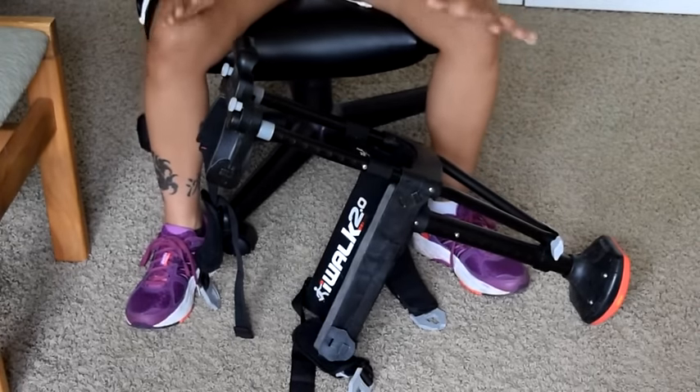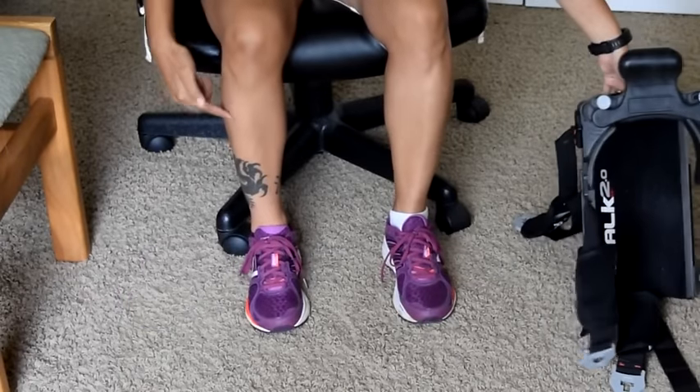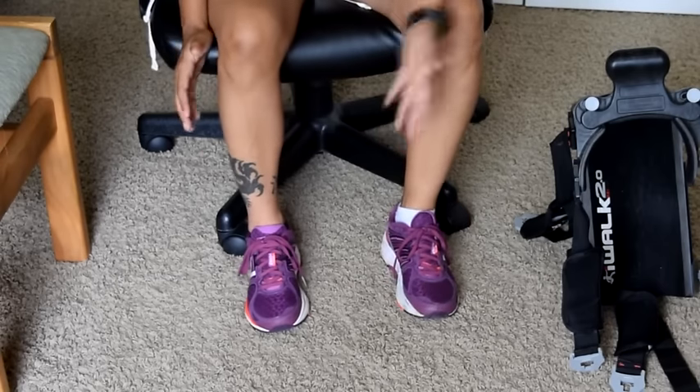I was completely non-weight bearing on this right foot here. In the video you might be able to see my terrible atrophy here on the left versus the right foot. Now I can actually put some weight bearing on.